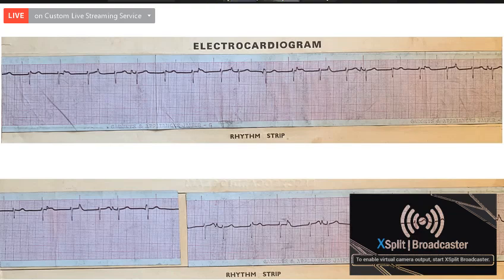That's the diagnosis. Usually the accelerated junctional rhythm will have a rate of less than 100, usually between 60 to 100. And this can happen associated with a pathology in the heart where the junction is stimulated and starts firing at a faster rate. It is an accelerated junctional rhythm with intermittent sinus capture. A very rare ECG. I don't think you would have seen one of this kind. It's an extremely rare ECG.